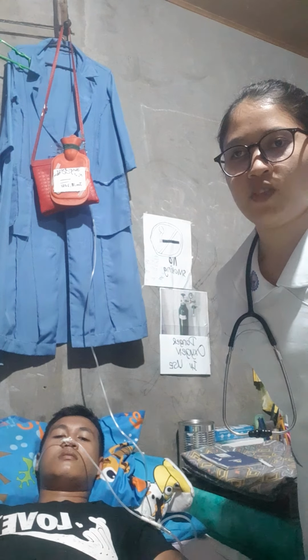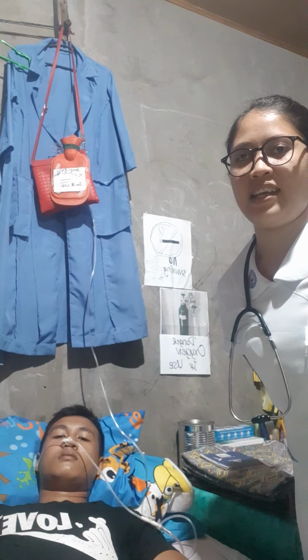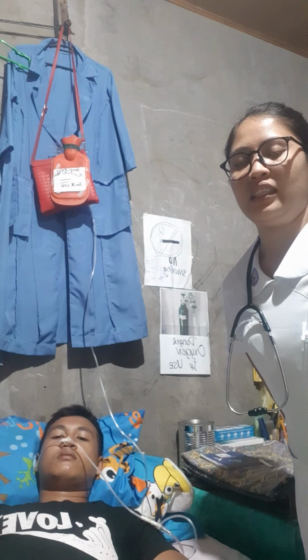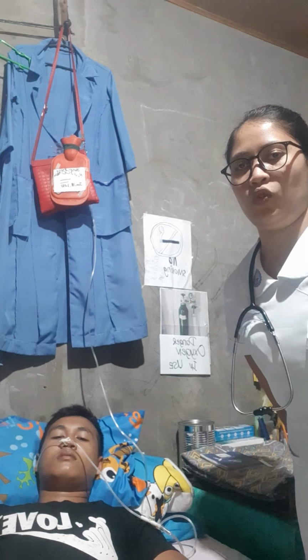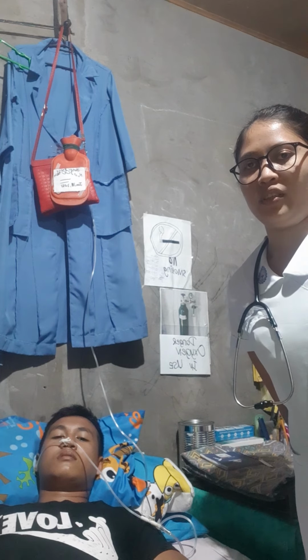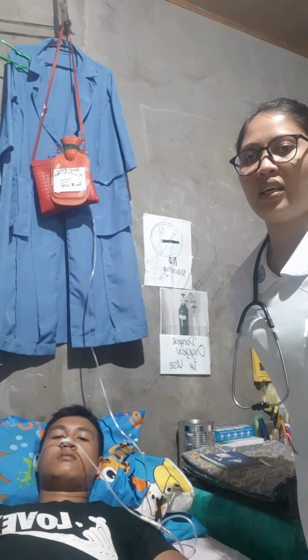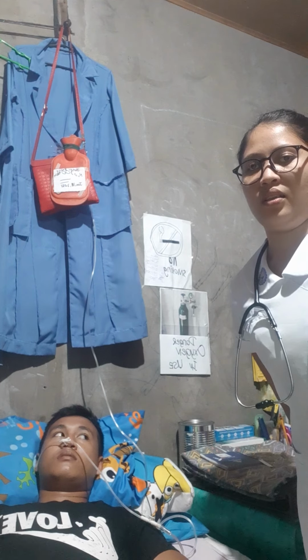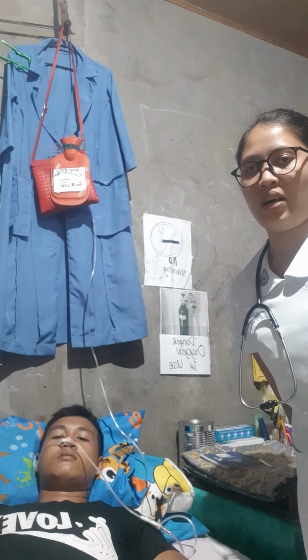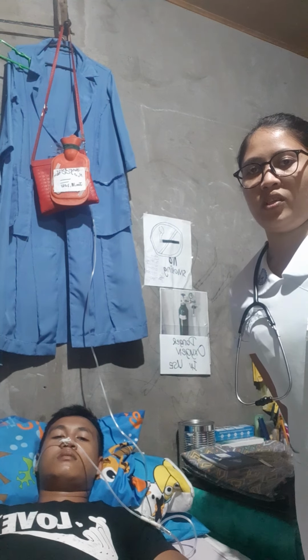Good day, sir. I am Chris Madel Tayopon, your nursing aide for today. And today I am going to perform removing a nasogastric tube. The equipment and materials needed are a disposable pad or towel, tissues, clean gloves, a 50 ml syringe, which is optional, and a plastic trash bag. Then we're going to proceed to assessment.